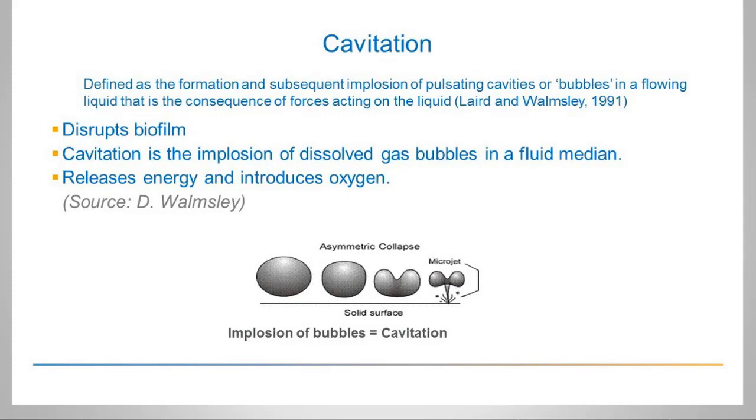The bubbles grow in size and then collapse inwards, or implode, releasing a burst of energy. This burst of energy enhances biofilm removal and may have the potential to disrupt the cell walls of the bacteria. And this diagram here demonstrates the implosion of the bubbles.